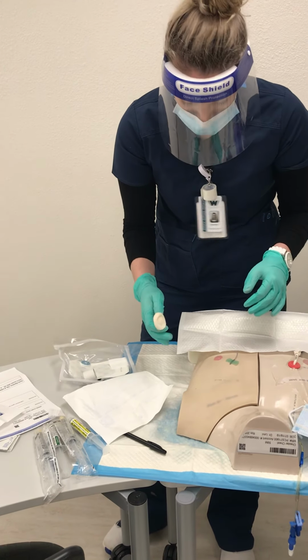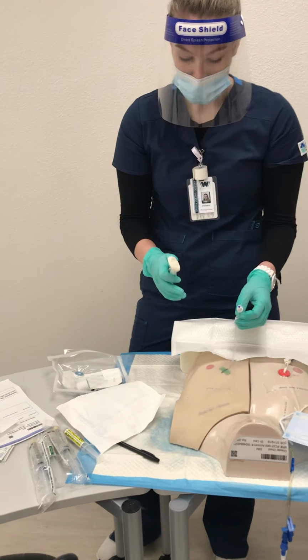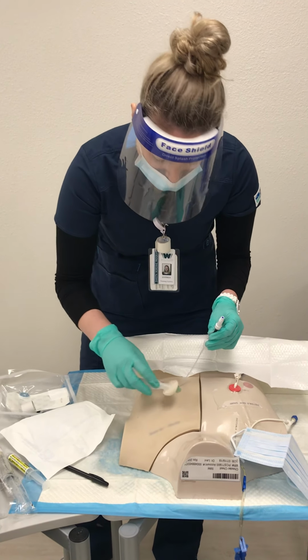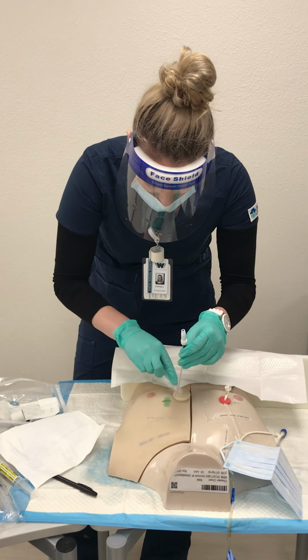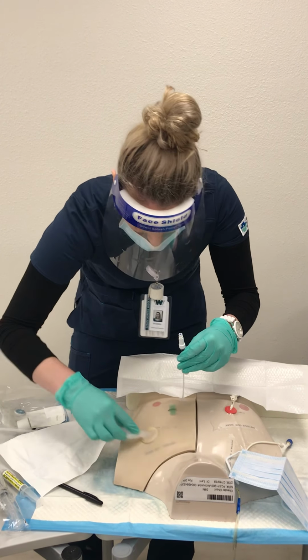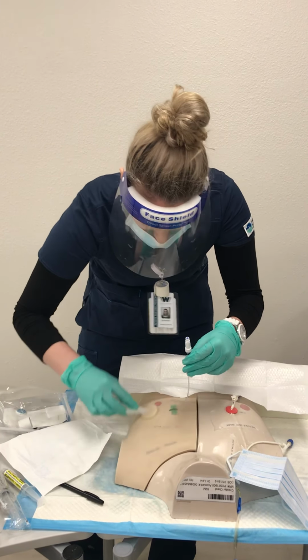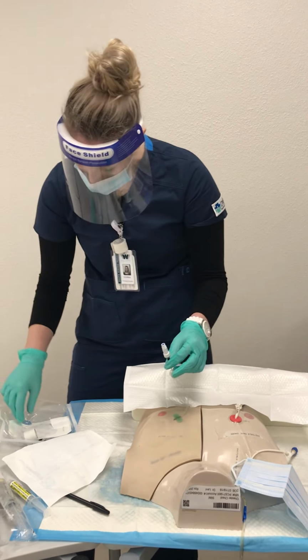So because I'm going to be cleaning, I'm going to have to make one hand unsterile. Sorry, I forgot to mention, after I took off the dressing, I would have measured the port, the length of the tubing. So I'm going to want to clean inner to outer, in a circular motion. And once that's clean, I can discard of that and then let it dry.